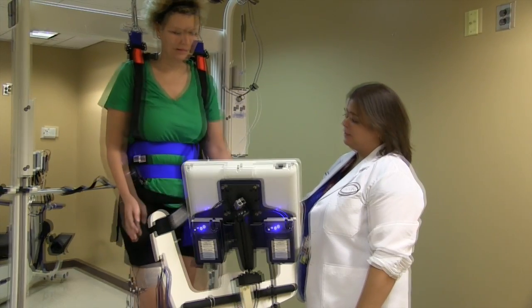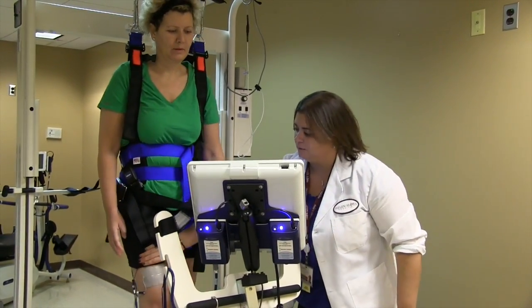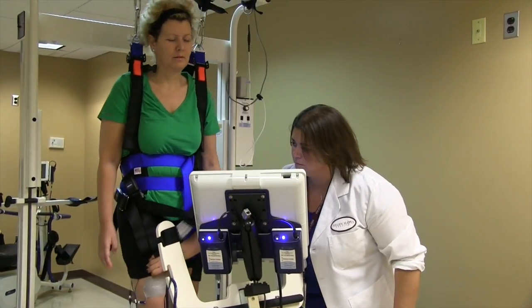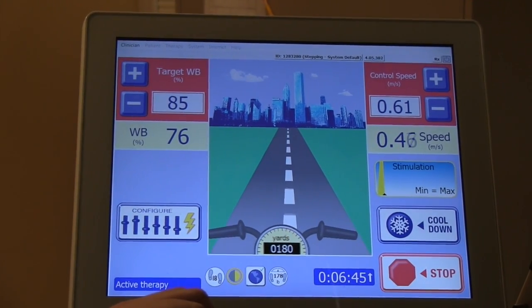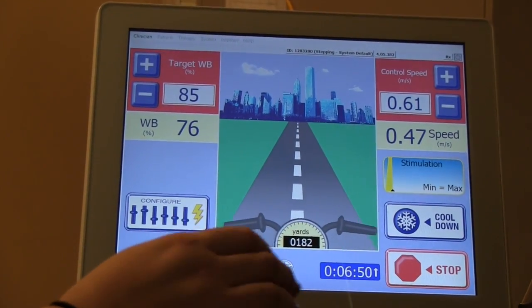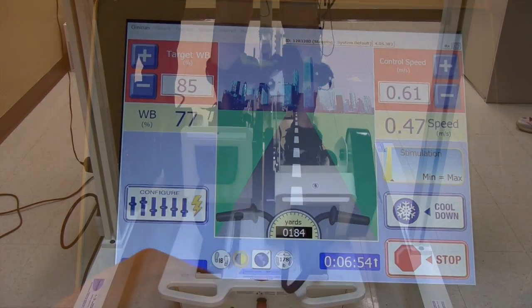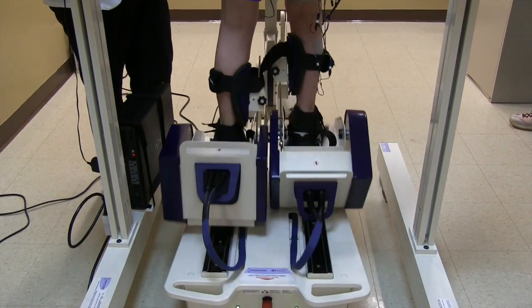I'm improving, working hard at it. Stim is all the way up to the level it's going to stay at. You can feel it on the quad — we're getting a good contraction. Continue focusing on that arm swing, keeping your head up. You can see your weight is shifting by the handlebars, going a little bit right to left, but that's normal when we walk. There's no significant asymmetry to one side, and your weight bearing is improving as we go.